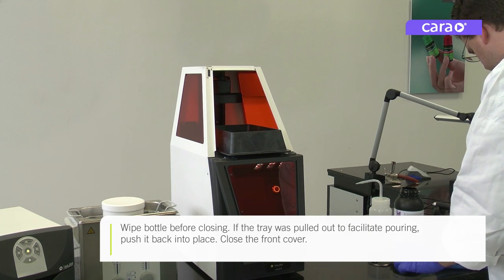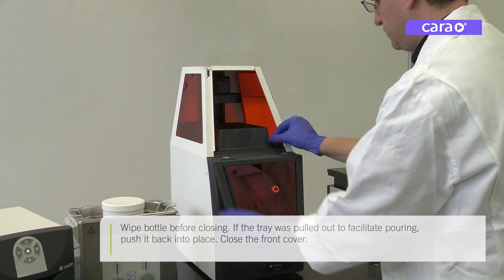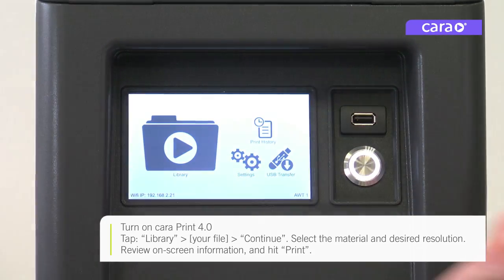If you pulled the tray out partially to facilitate pouring, push it back into place when finished. Then close the front cover and turn on CaraPrint 4.0.